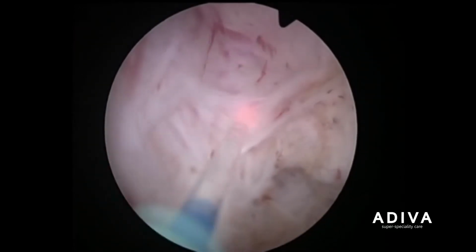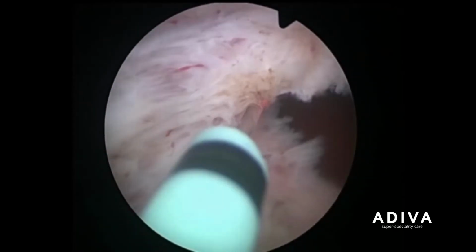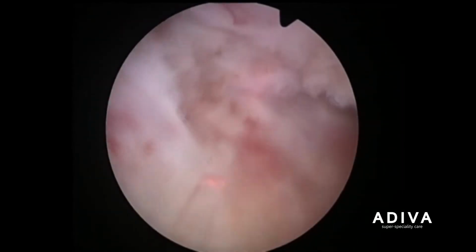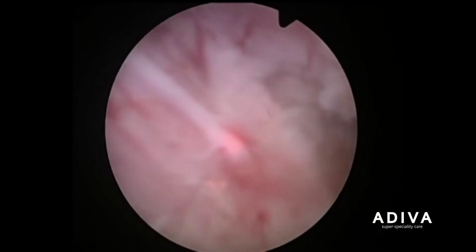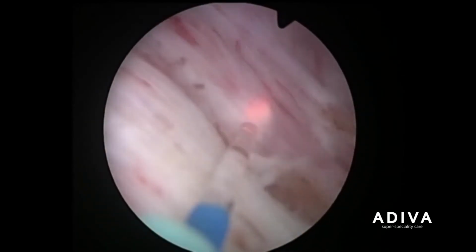I hope you are able to appreciate these fibers, which are the capsular fibers. And here, again, the blood vessel which is bleeding, we are able to coagulate with the laser. All this is stopping the bleeding by laser.